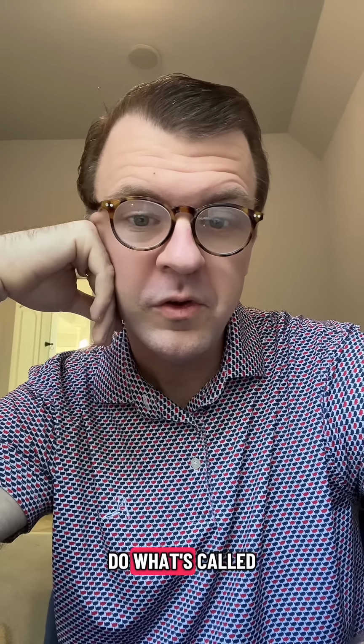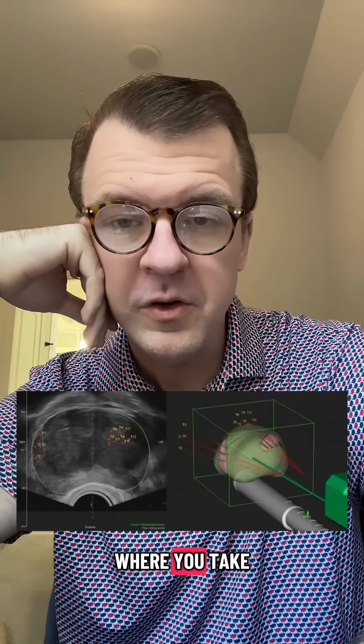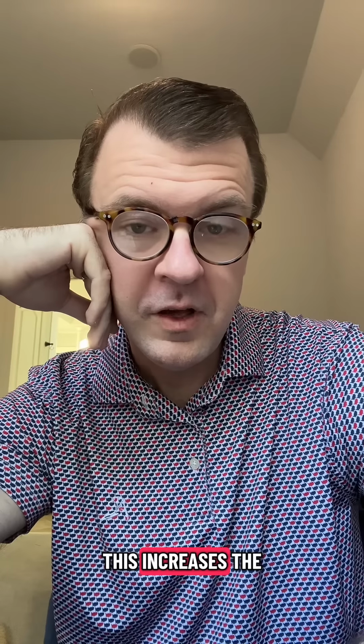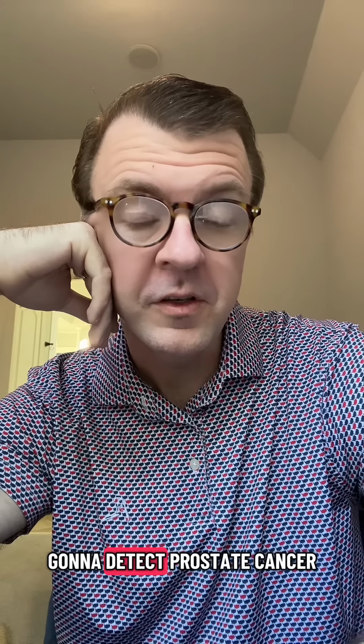So once you've used the PIRAD score to determine if there is going to be a prostate biopsy, then you can do what's called a fusion biopsy, where you take the information from the MRI, identify where the lesion is, and target it. This increases the chance that you're going to detect prostate cancer if it is present.